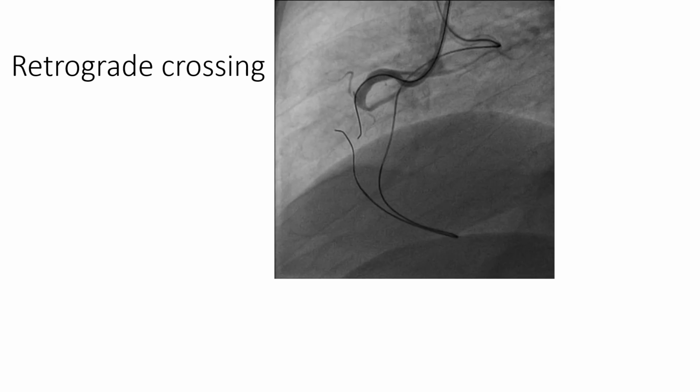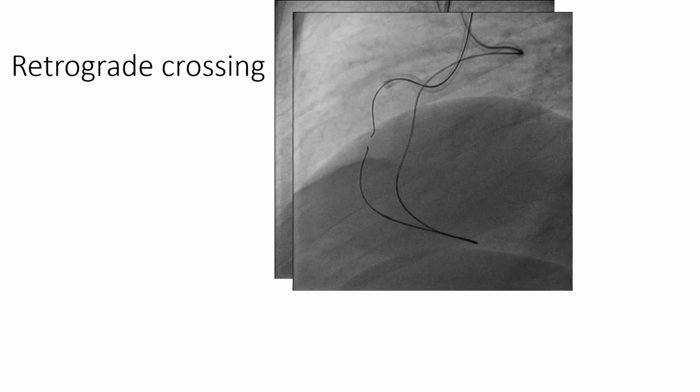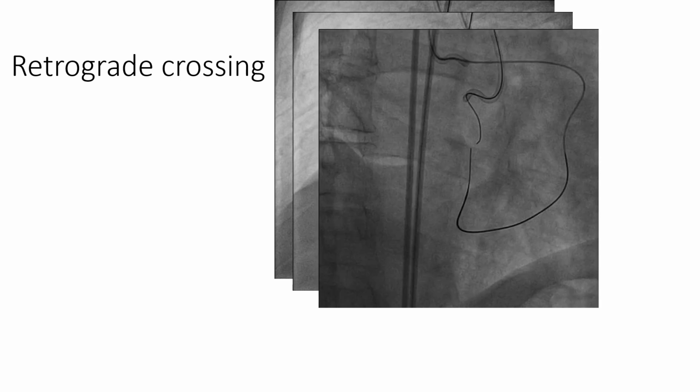Once the microcatheter reaches the distal cap, the wire is exchanged for a CTO wire. That is a harder one, and here we used the Miracle 6. Always, you have to take orthogonal views to make sure that the wire is in the correct direction.